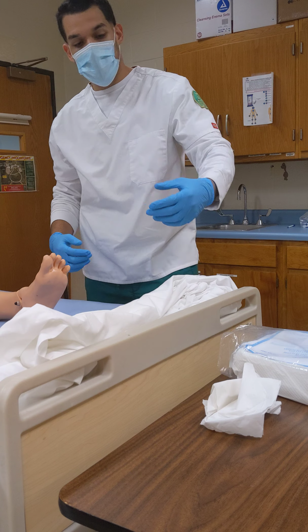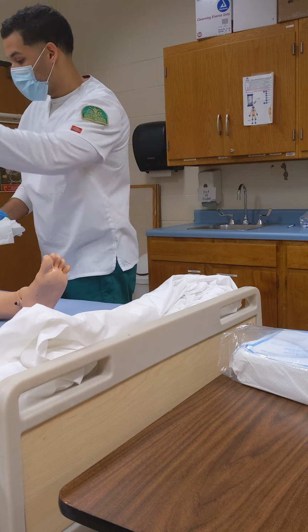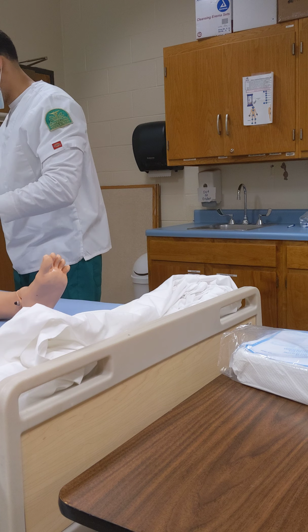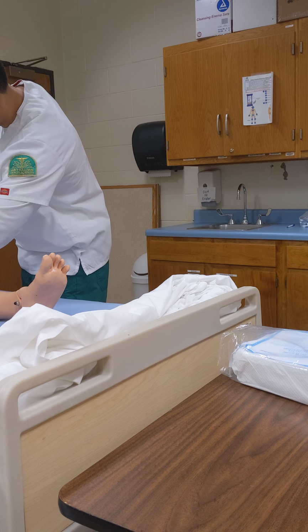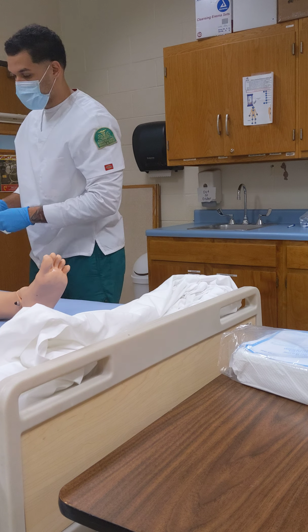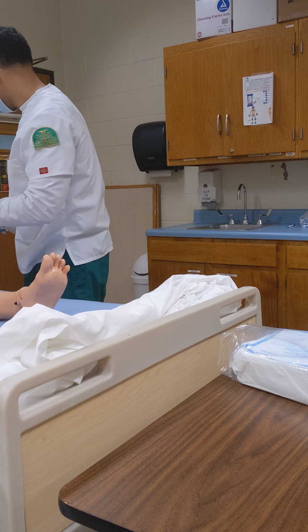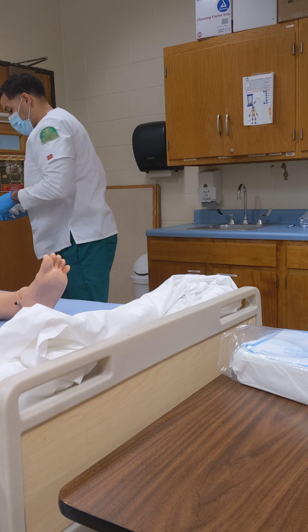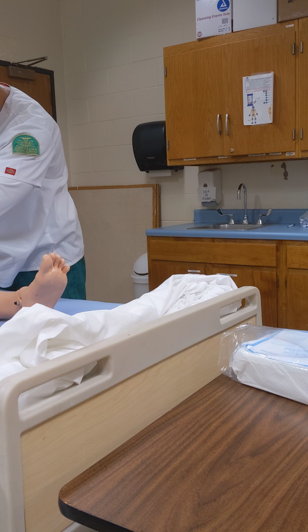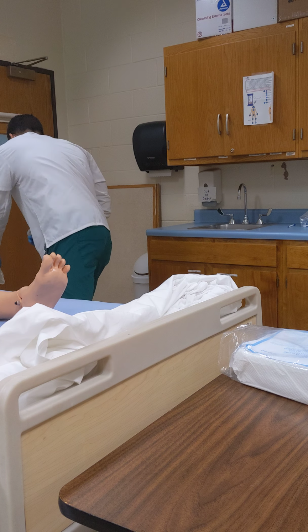I would get my washcloths to perform pericare. Start by cleaning with one on the furthest side away from me. Then the closest. And last but not least, from top to bottom, all the way down to the anus.